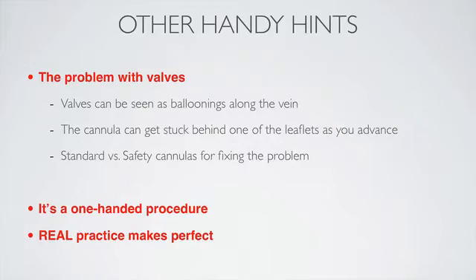One, if you've already gained IV access and the only purpose you're doing cannulation is to gain IV access, don't worry. Take the stylet out, apply your bung and seal it up. Flush it to just ensure you have IV access, and that should be fine as a port for infusing intravenous fluids or whatever you need that cannula for. Particularly if you need the cannula for intravenous induction, the anaesthetist can give the medication through that drip and then later on re-site the cannula.